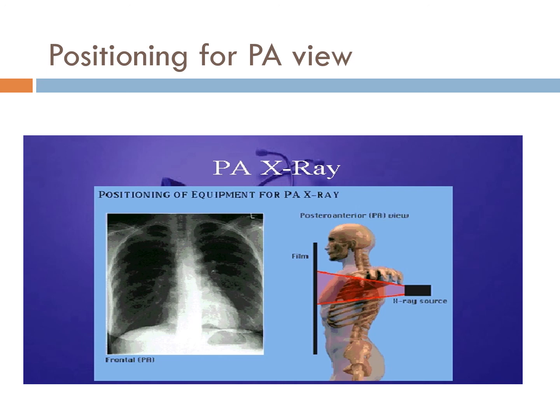But basically when you're viewing that film, you have the picture, and if the rays have come from the back to the front, you're looking at more of a posterior image, I guess, because your left side is obviously on the right side of the picture itself.